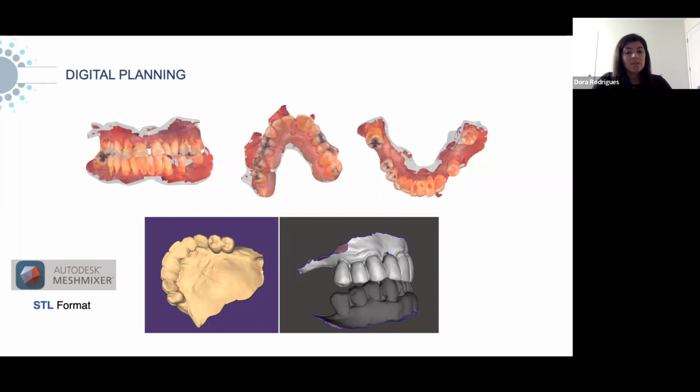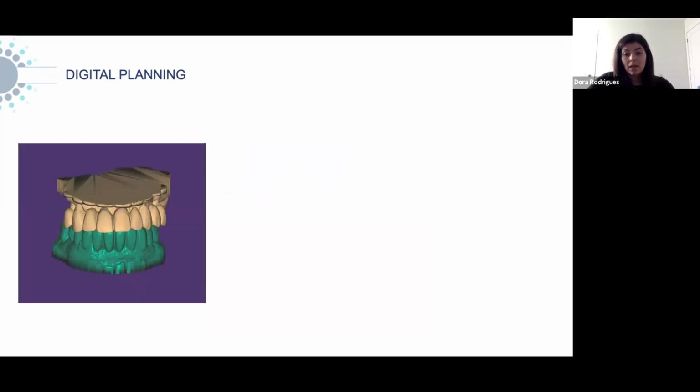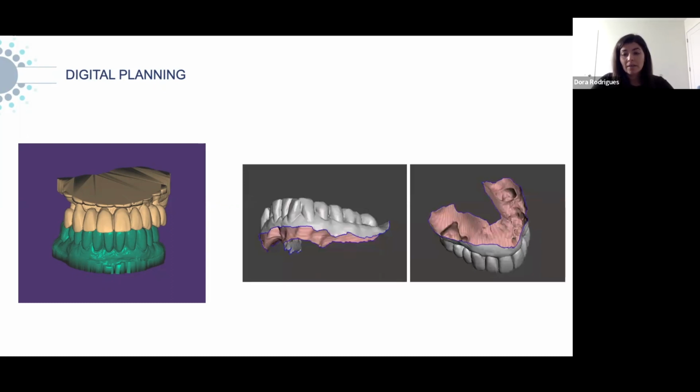For this, basically all you need is that software. You open your scans. If they're aligned, you can just print those models from there and start working on them. Now, it's not that easy when those intraoral scans come in. If they are closed, with no holes, like in this case, where the doctor sent me these scans, it looks a bit weird, the base and all, because the doctor himself closed those holes on the scans. So I could send this to my printer and print them right away. Now, most of the time they come like this, all open. So you cannot just grab this file and send it to your printer. You have to work on them.